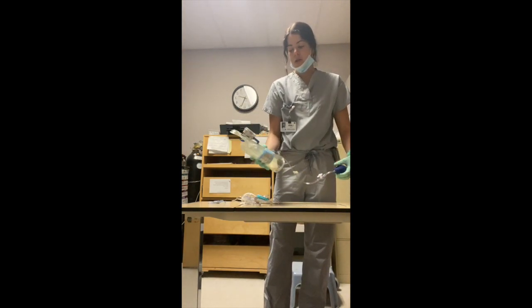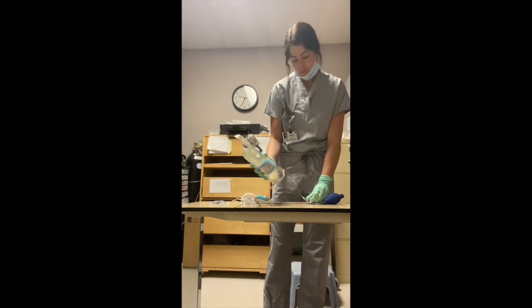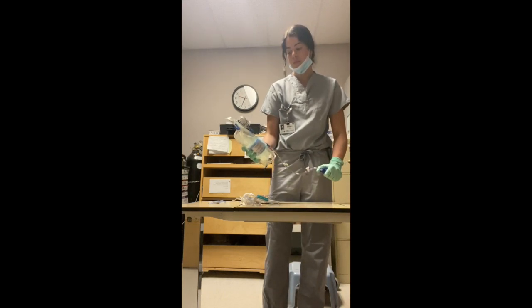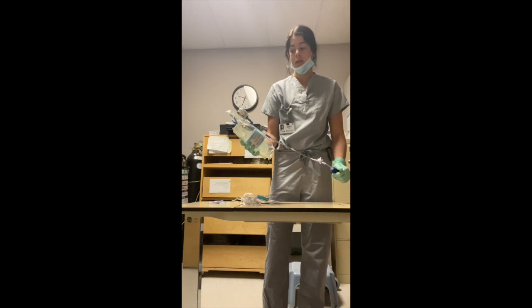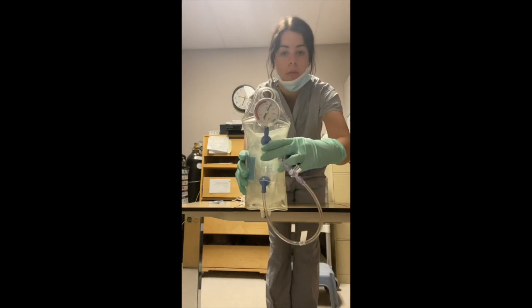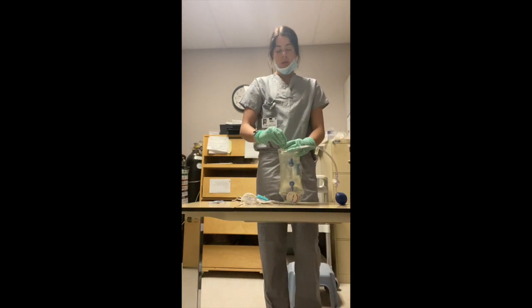So we're just going to start by pumping up the pressure bag, and it's going to be pumped up to 300 millimeters of mercury, which prevents backflow into the patient's system because it is far over the systolic pressure. So there's 300 there now. And next what we're going to do is spike our bag.